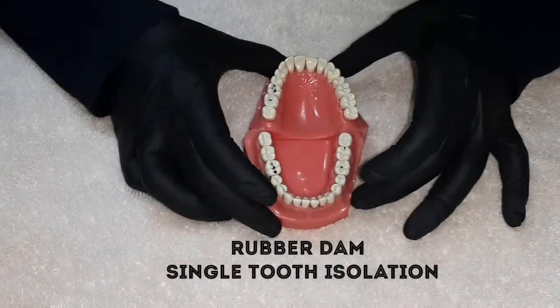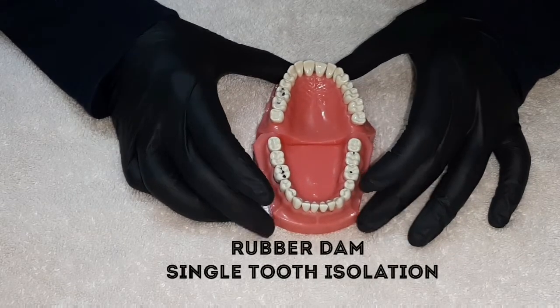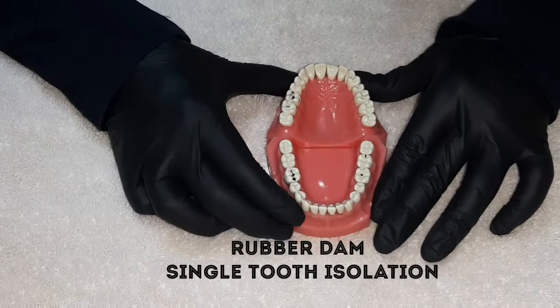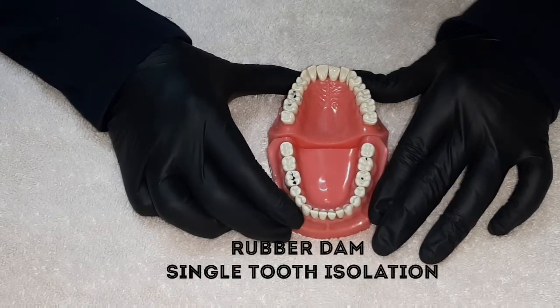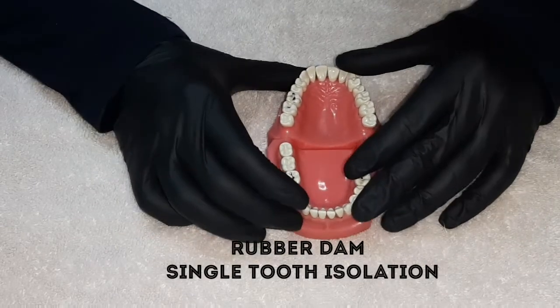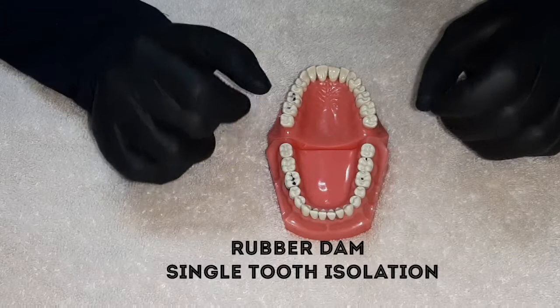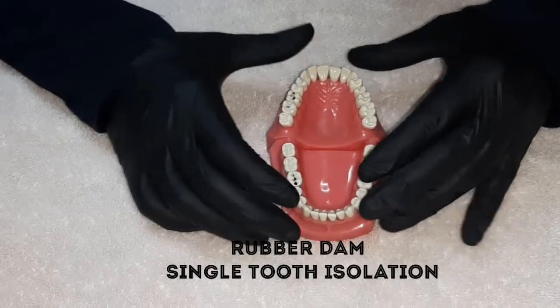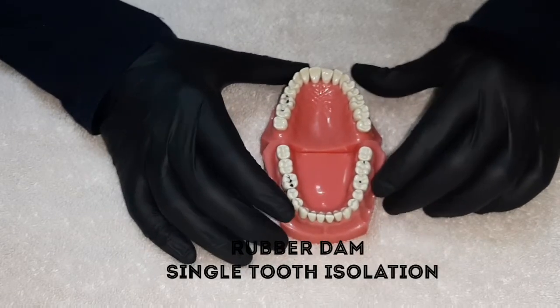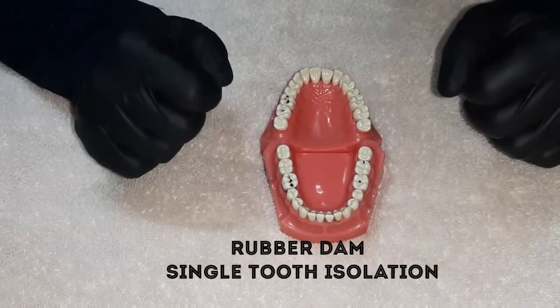Hello everyone, welcome to the next module of virtual training. Today we will be talking about rubber dam and the technique to isolate single teeth. I would be introducing you to all the parts of a rubber dam kit, followed by the techniques that are usually very famous for using rubber dams. Today you will be learning how to isolate anterior teeth and posterior teeth, what basic techniques are used.